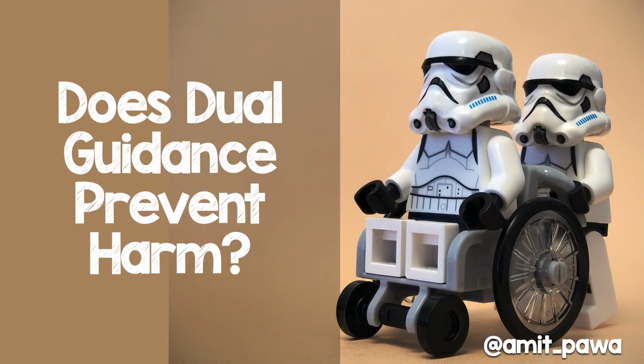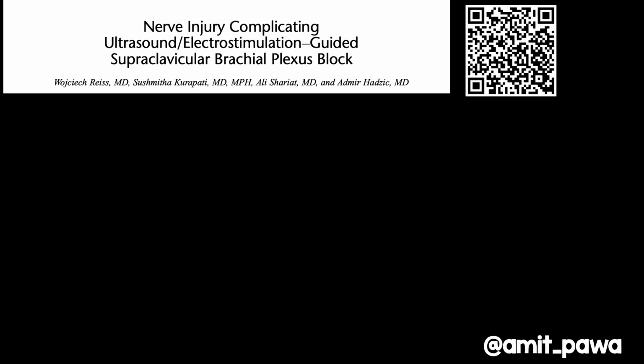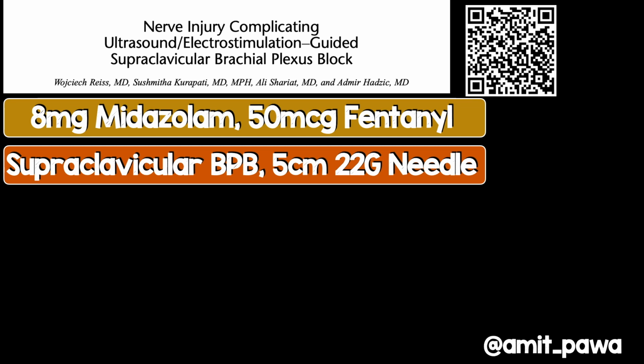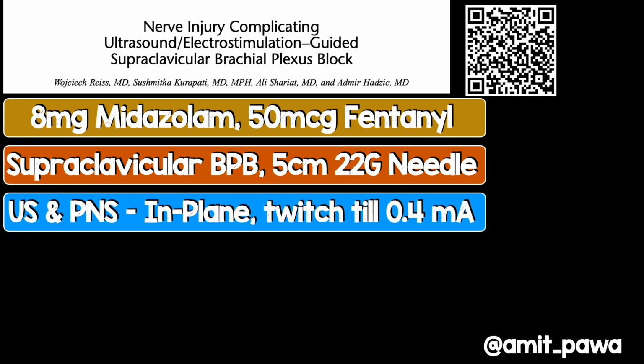Now, we always talk about safety. So does dual guidance using peripheral nerve stimulation and ultrasound prevent harm? Well, I'm going to show you a very sad case here, actually. In this case, they used, well, I think this is pretty heavy sedation, but apparently the patient was responsive. They used 8 milligrams of midazolam and 50 micrograms of fentanyl for sedation, and they performed a supraclavicular brachial plexus block using a 22 gauge 5 centimeter needle.